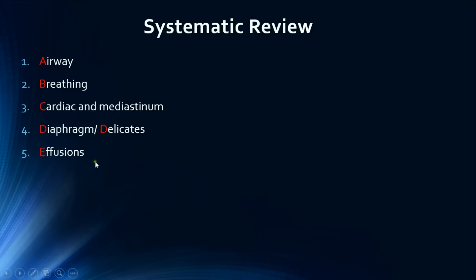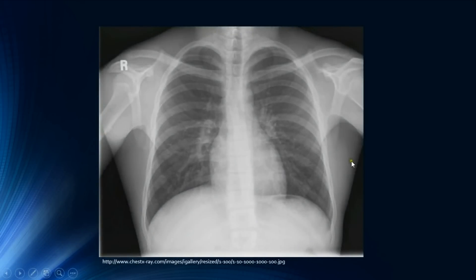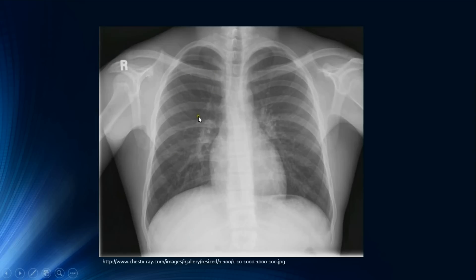Now let's apply the systematic review to this normal chest radiograph. A — airway: the trachea is central and not deviated to either side. B — breathing: we inspect the lung fields for lesions, paying special attention to the apices, which appear clear, and then the hila, where we can see clearly the bronchovascular markings in both hila. We also assess the costophrenic angles for effusions.